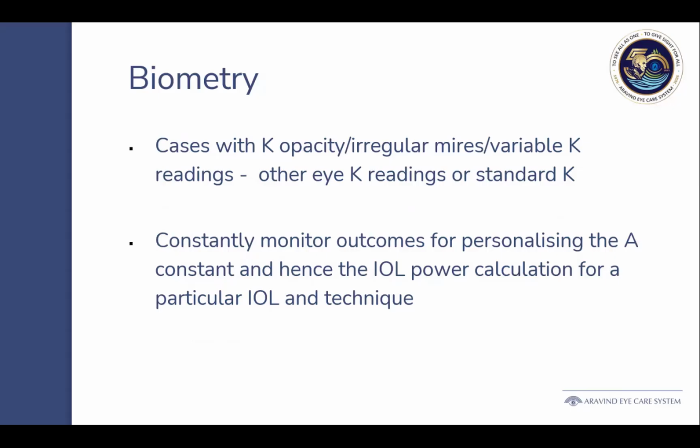Constantly monitor the outcomes of these cases, every type of IOL for every surgeon, so that you know that when you're doing this particular type and this particular IOL, then you need to adjust your IOL power calculator accordingly.